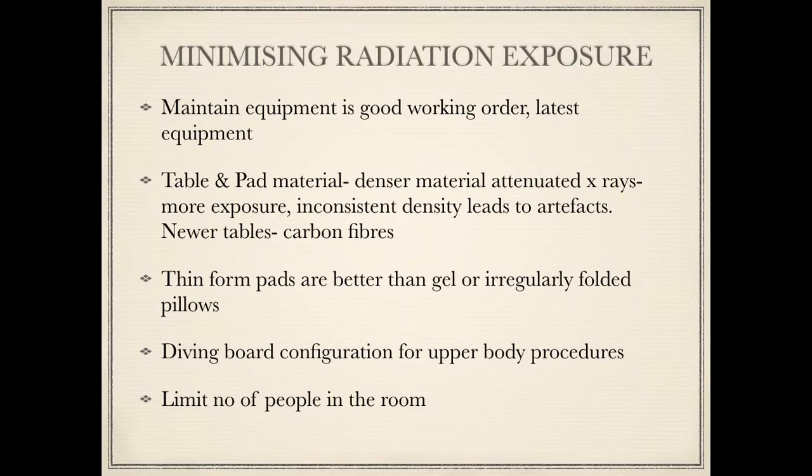Even things like the material of the table or the padding used on the table make a lot of difference, because if the material is quite dense or uneven, it can either compromise your image or produce artifacts. So the newer tables which are coming are carbon tables, and taking images through these requires less radiation. Things like foam pads or gel pads, if they are irregular, again affect the image quality and the amount of radiation exposure.